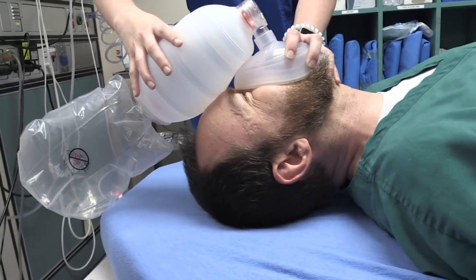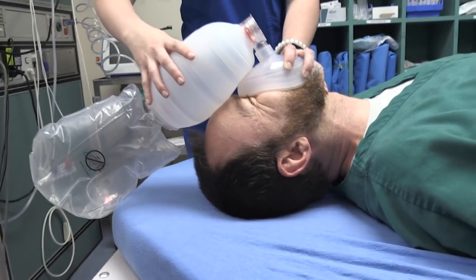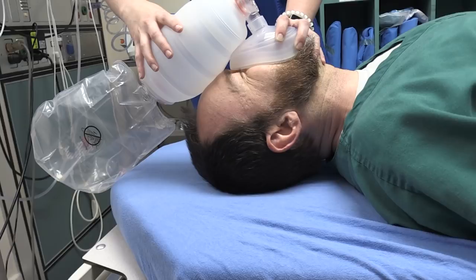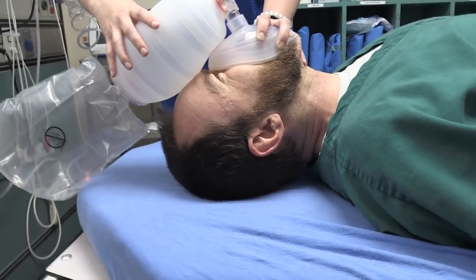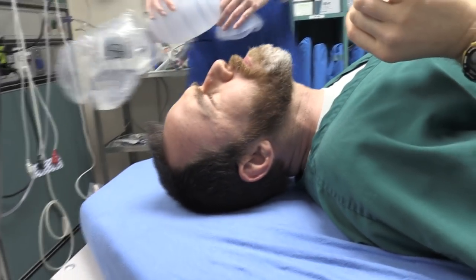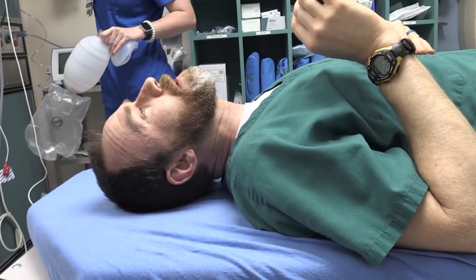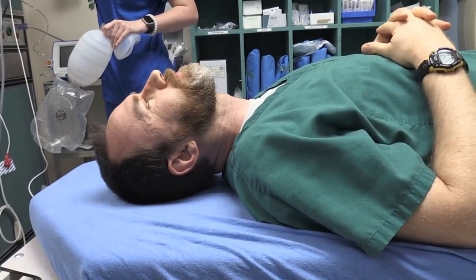Have we caused a pneumothorax yet? No barotrauma? Not yet. Okay, breathe one more time. And that's fairly effortless breathing, right? Or is it completely effortless? You can take the mask off. There's a minimal amount of resistance noted, but it's not difficult by any stretch. Okay, good enough.